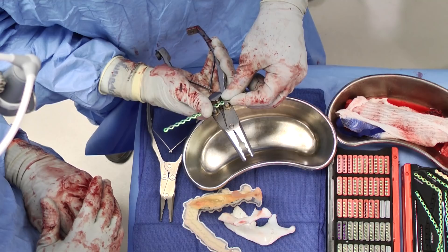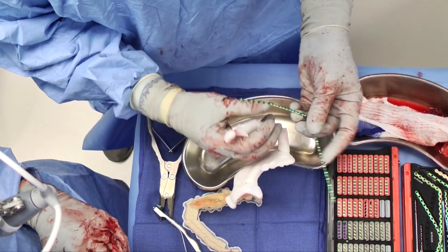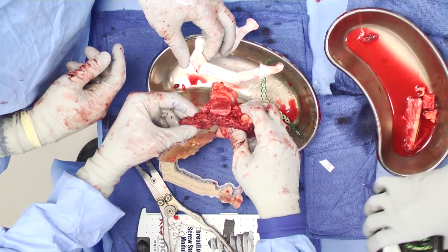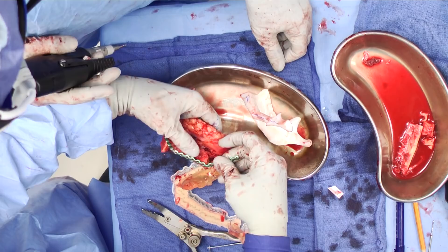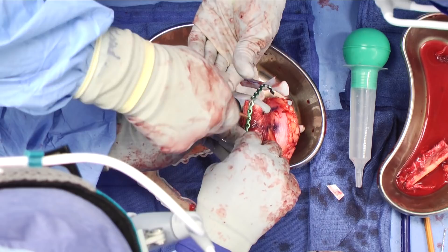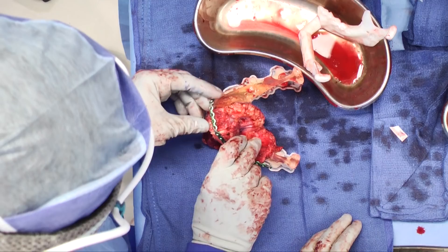Use of a pre-formed model to help bend the plate saves a lot of time. This is showing bending of the titanium reconstruction plate contoured to the reconstruction model. After the plate is contoured to the model, we can ensure it will fit precisely against the fibular segments cut with the cutting guide. The fibular segments are placed against the model to verify appropriate length and angles; adjustments can be made at this point if necessary. If the cutting guides were designed and used properly, no adjustment should be necessary. The segments are then plated with monocortical screws to the reconstruction plate, and the construct is ready to be inset. Use as few screws as necessary into the bone to prevent devascularization or excess foreign material being implanted.